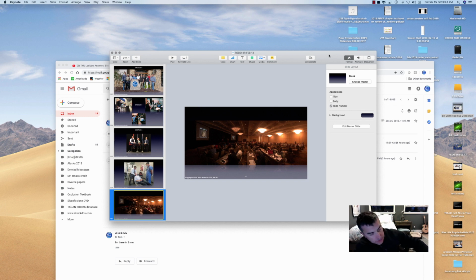You know, when I do fillings and crowns, the first thing I have my assistants do before I even numb the patient is I have them do a T-scan. This is a normal practice. This isn't even TMD world. You come in for the crown tomorrow, first thing we do is have you bite on that sensor and grind around. And then we have that in the record. And then let's say I do your crown, and in my office, you walk out 2 hours later, finished, because we're doing CAD CAM. I've done it for 12 years. I've cut half as much tooth away, and you're less likely to have any root canal problem or sensitivity.